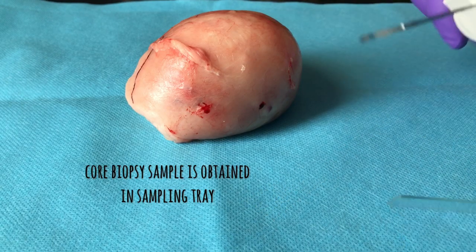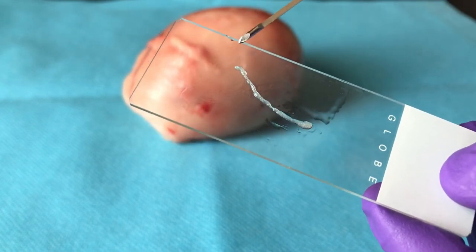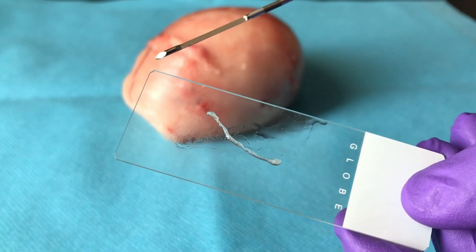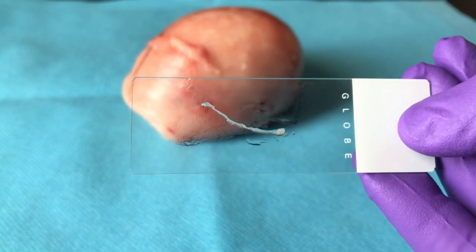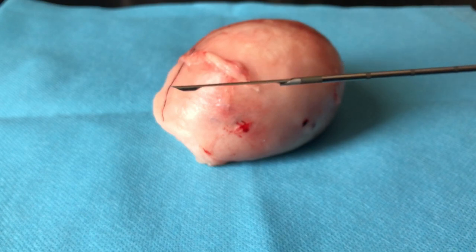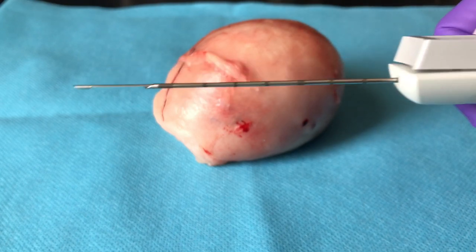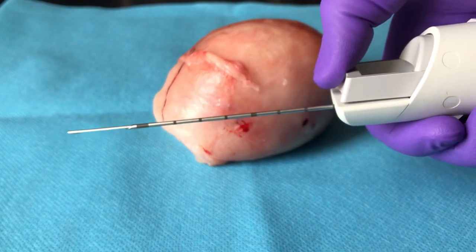This is how small the tissue we can take out from the tumour sample. This sample can be put in formalin for histopathological analysis. As you can see, I am loading the gun again to take a second biopsy sample.